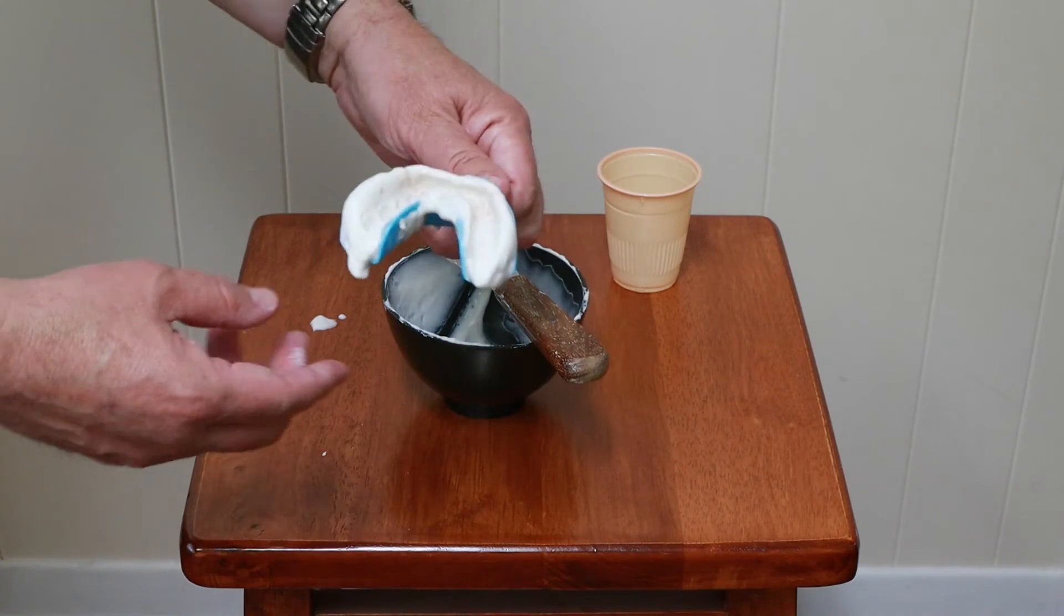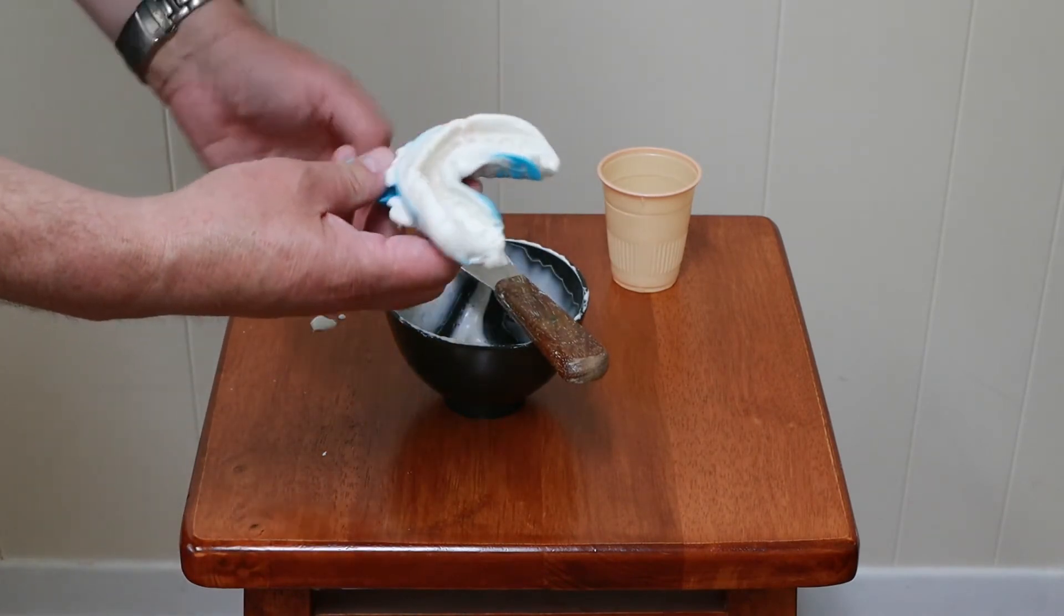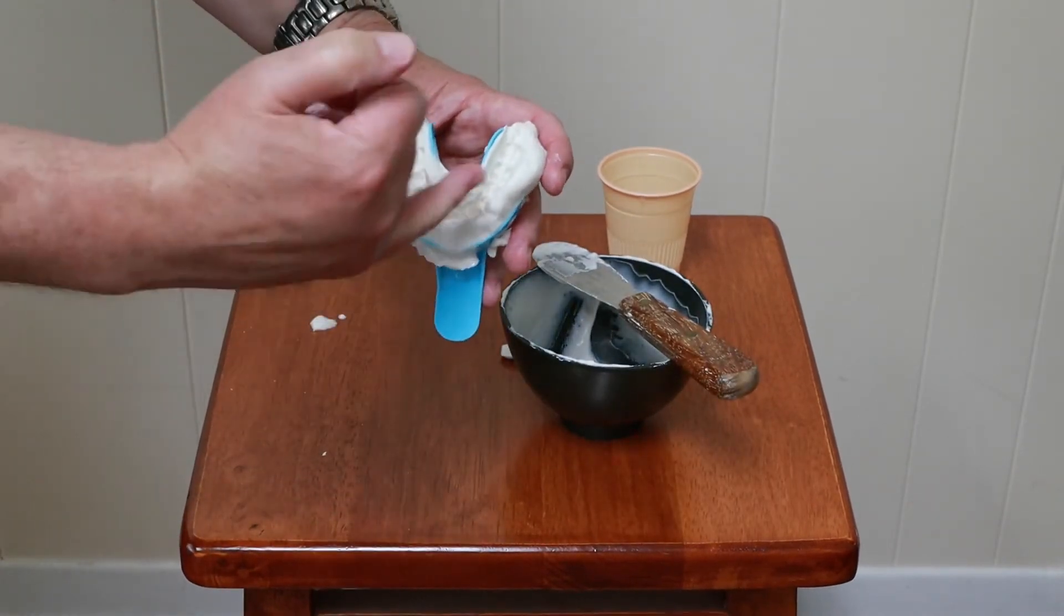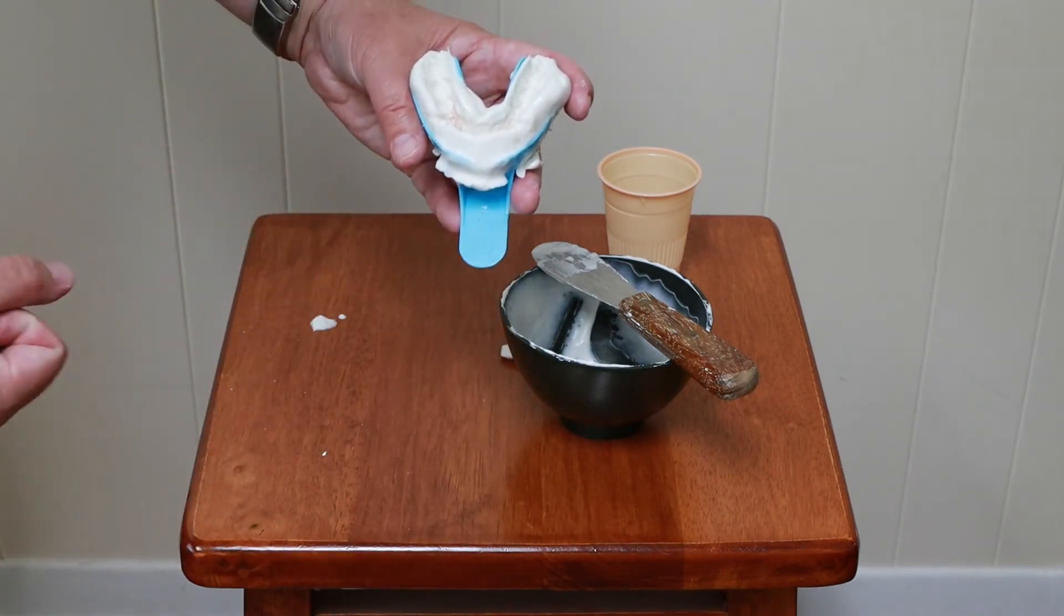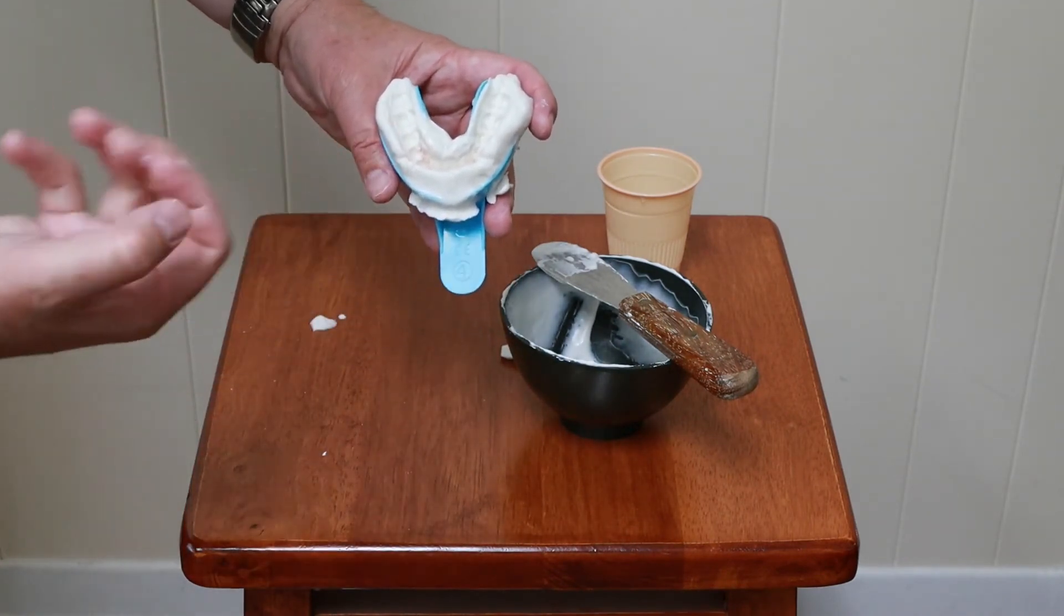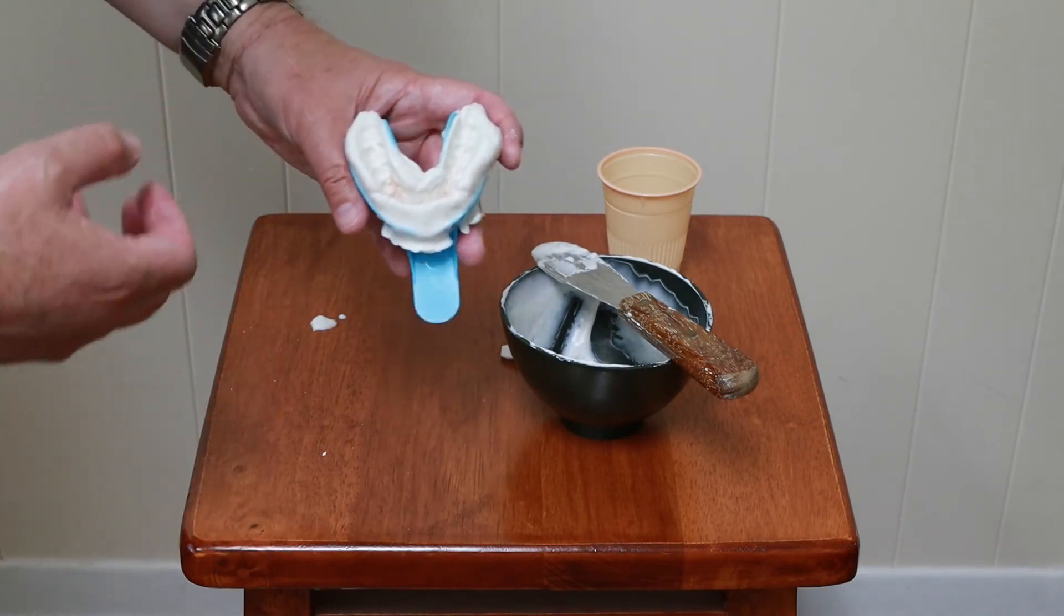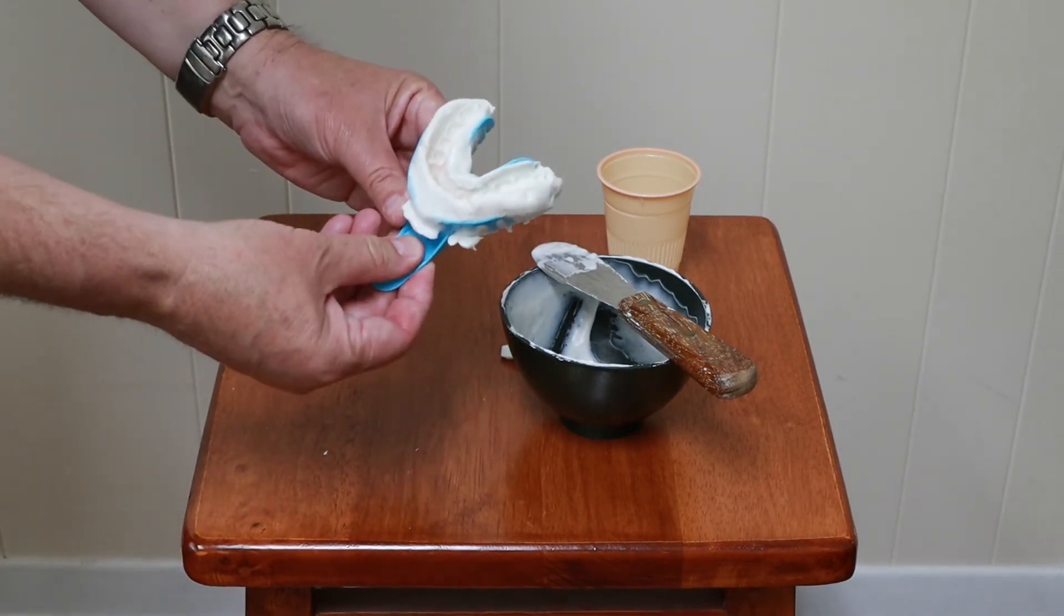So, now that I have this mold, now that I have this impression, I'm going to pour it up, basically add some dental plaster in there, let it set up, and then I will have the plaster model that I'm going to use to make the whitening tray on.